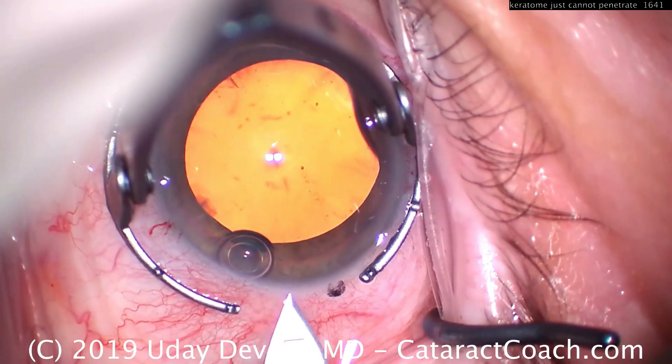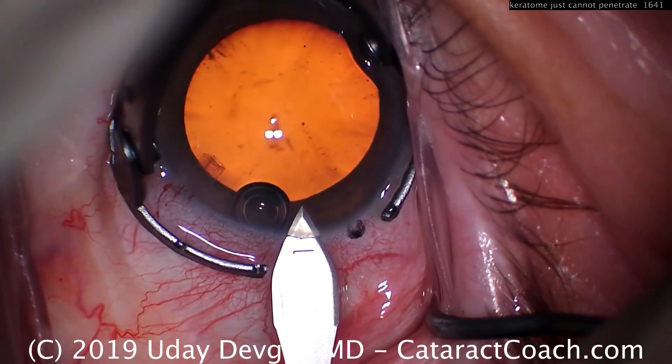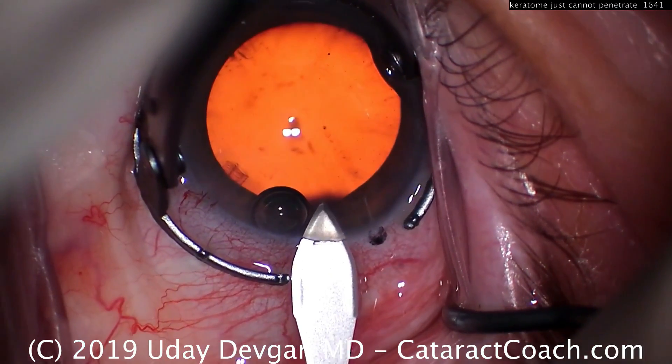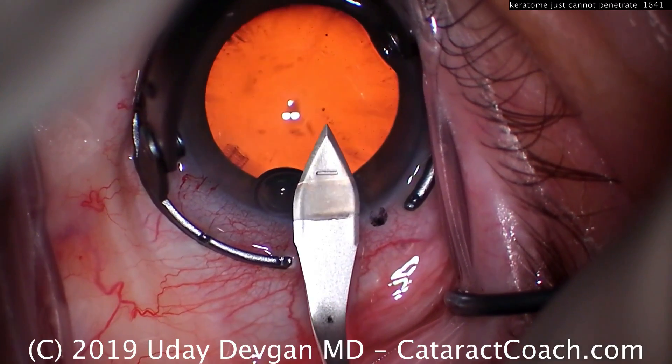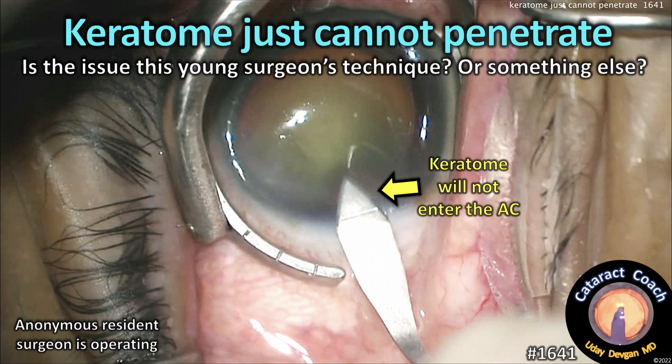Now the keratome is in perfect shape — it's nice and sharp, untouched. You can see when we do this incision, it's much easier, much better. Smoothness there — goes in and out quite easily. So now the message is clear: if you have a case where the blade just doesn't want to enter the eye, think about a damaged blade, and get a replacement blade to make your life a whole lot easier.